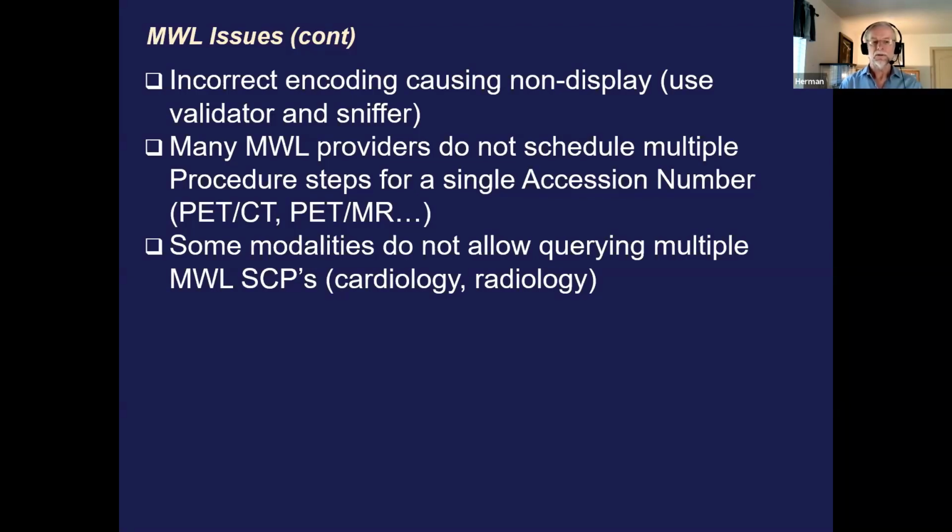What if you don't do that? Well, we might have to use some kind of what we call middleware, get some application that queries both worklists and that provides a single worklist back. Middleware providers will do that for you.